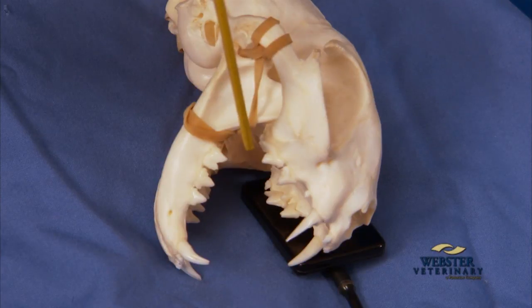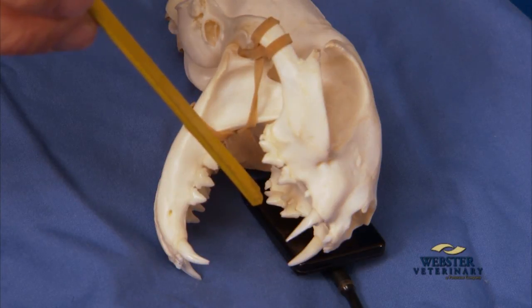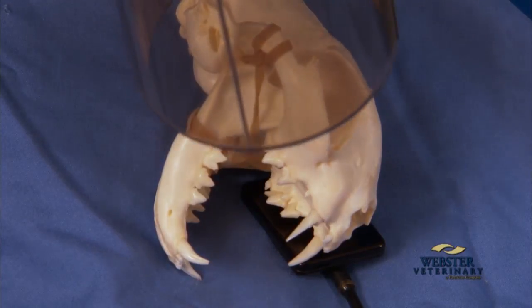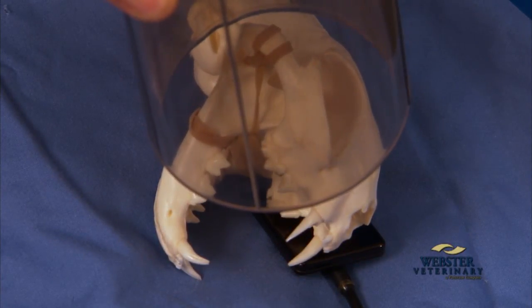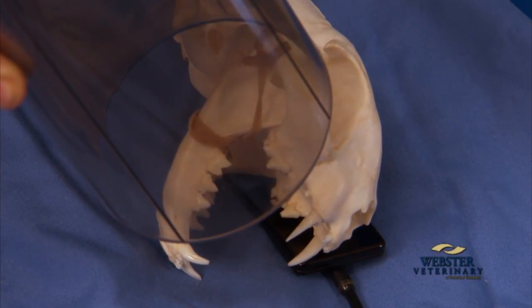The X-ray beam is placed in a parallel, then moved into a near parallel positioning to create this image. Again, the cone is moved into a parallel position and then moved into a near parallel position for the resultant image.